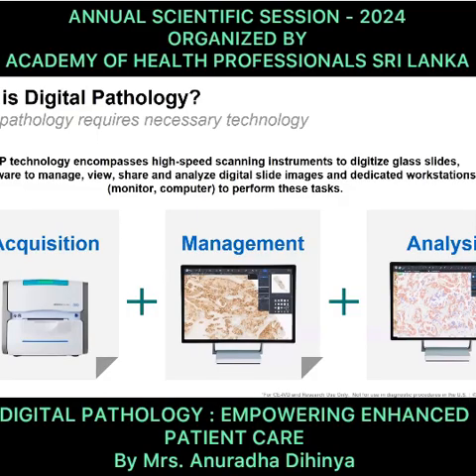Because they are the key pillar to establish digital pathology in the anatomic and surgical area. They are the key person who works along with the pathologists as well as the histotechnicians to give a digital transformation in surgical pathology.